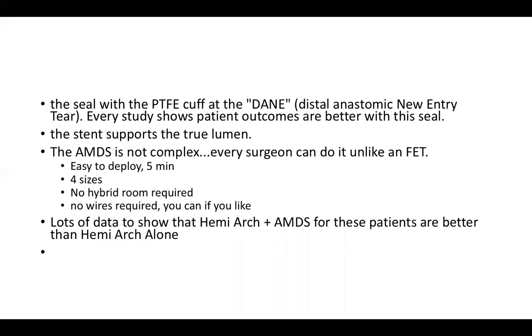So just to summarize, this new stent graft is becoming more and more a very important adjunct to surgery for type A aortic dissection, and I think will be obligatory down the road, as it supports the true lumen. And like I said, the goal right from the beginning was that every surgeon can do it, and it's easy to deploy, minimum risk, easy to size, no hybrid room, no wires, no interventional radiology, no fluoro required.